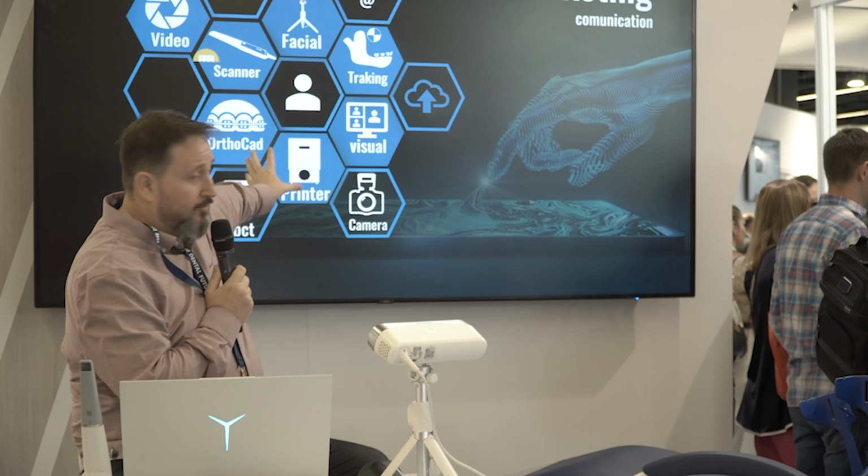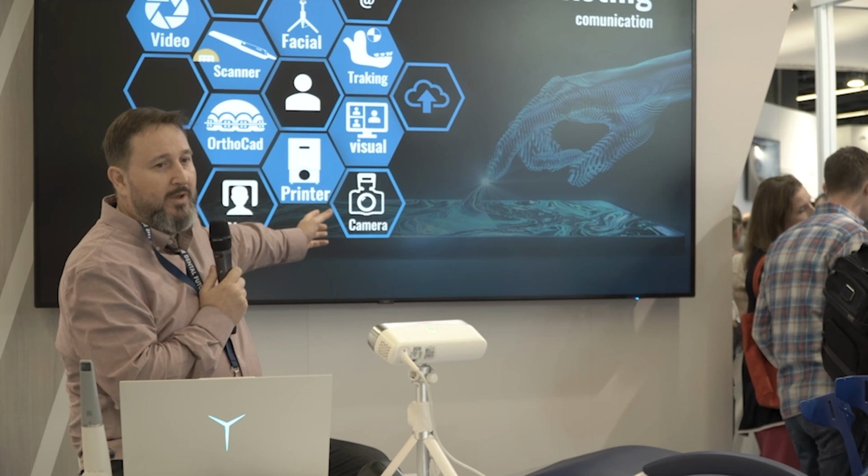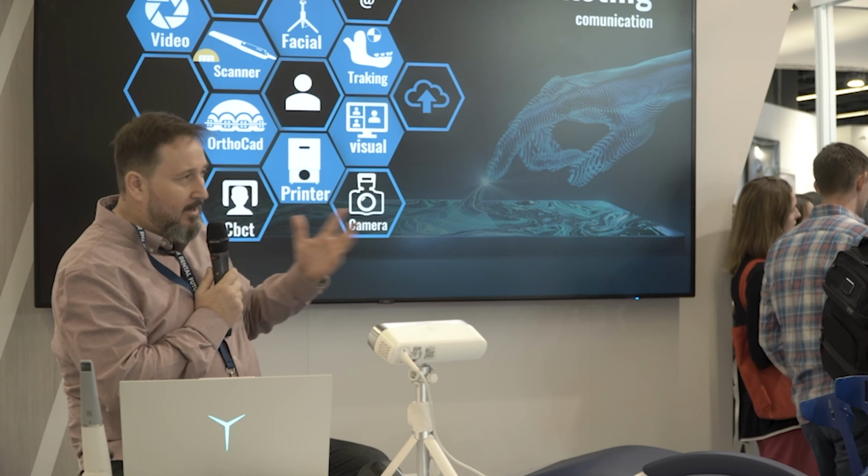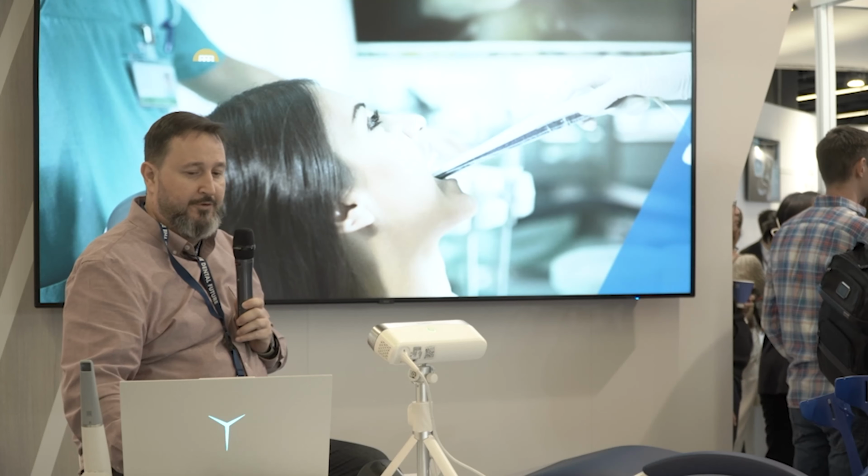But you don't have to forget that you can upload it to the website, okay, where we have a cloud, and any collaborator can download and work directly with it for making, for example, a treatment plan. Okay. Don't forget the camera.